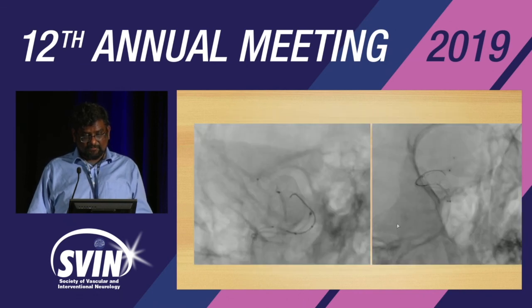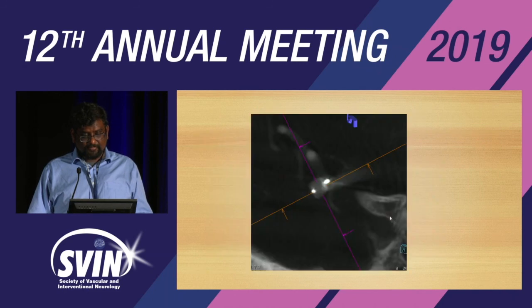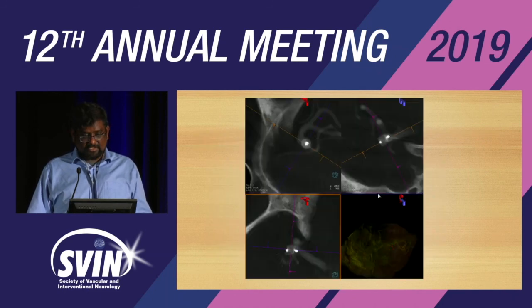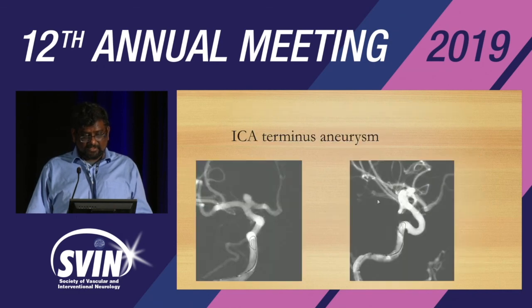So we're going to keep going. So I mostly do a dyna-CT for follow-up. You can see that the parent vessels are preserved. So here are some tips and tricks.